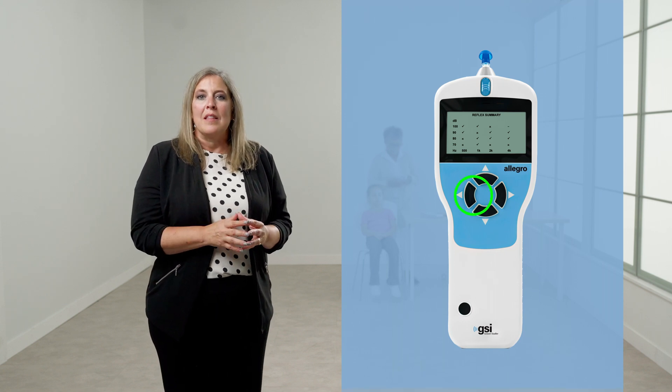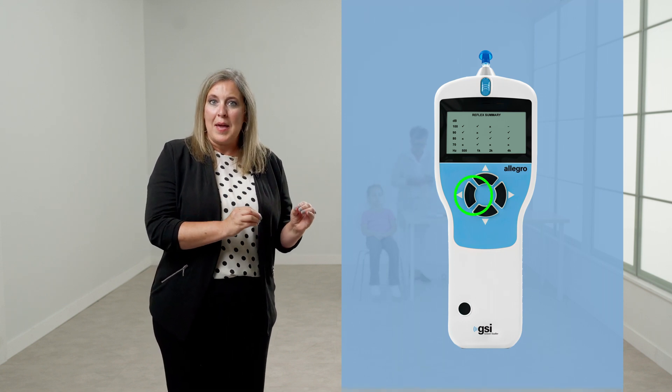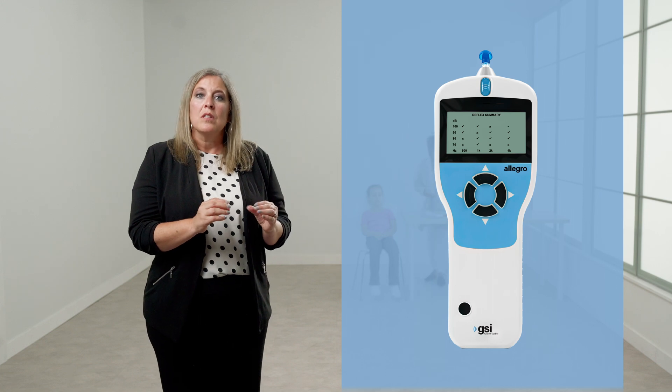It is possible to press the left button to return and view the tympanogram, the reflex results, or to repeat the test. When satisfied with all of the results, press the right button. If test both ears was selected at the beginning of the evaluation, you will be prompted to insert the probe into the other ear and the entire sequence will be repeated.